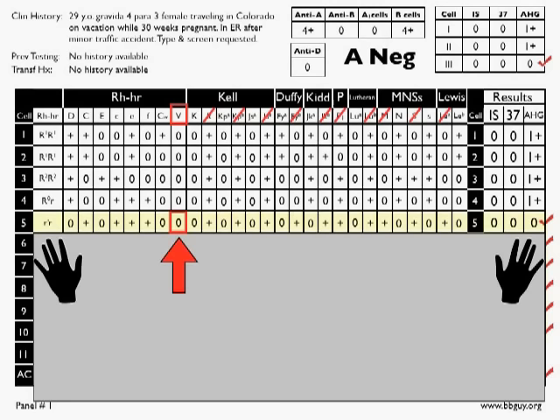We move on to f. Remember, f is a compound antigen, which is present when you have little c and little e on the same chromosome. In other words, when you have a little r haplotype or a big R0 haplotype. And that is obviously the case in cell 5. So that antigen is present. You have no reaction. You put a single slash through f.